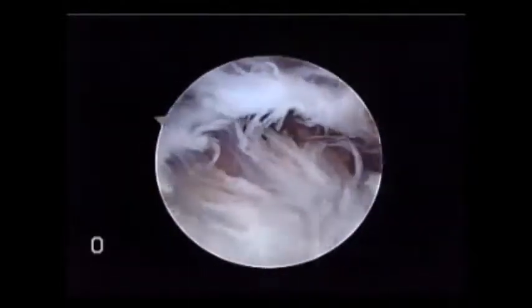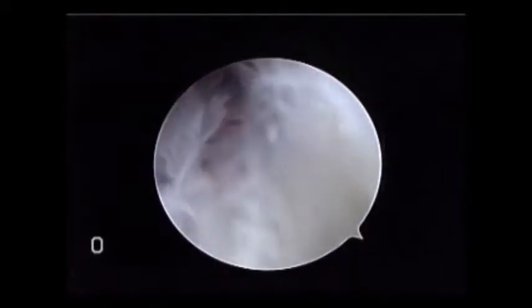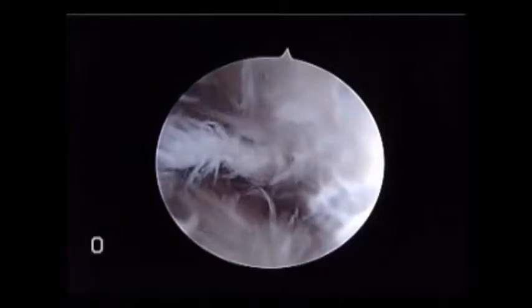Arthroscopic capsule release in the elbow can be very complicated and a difficult operation to carry out successfully. As we can see here, we insert the camera into the anterior compartment of the elbow. It's very difficult to appreciate the orientation and even the capsular and bony anatomy.